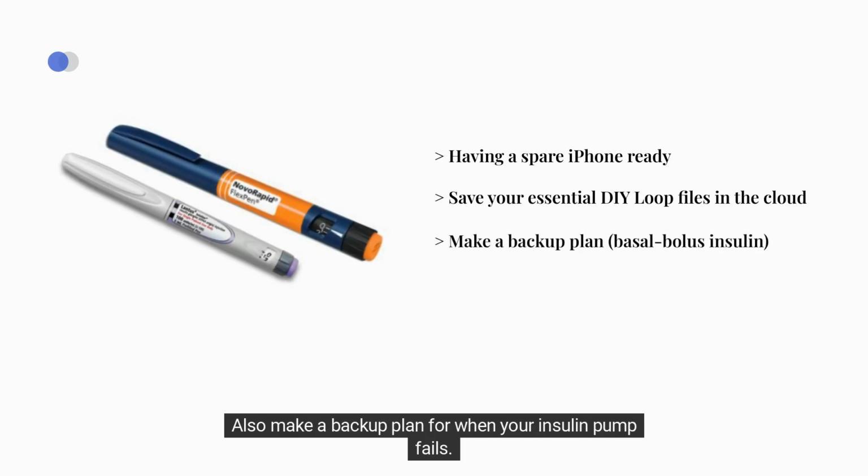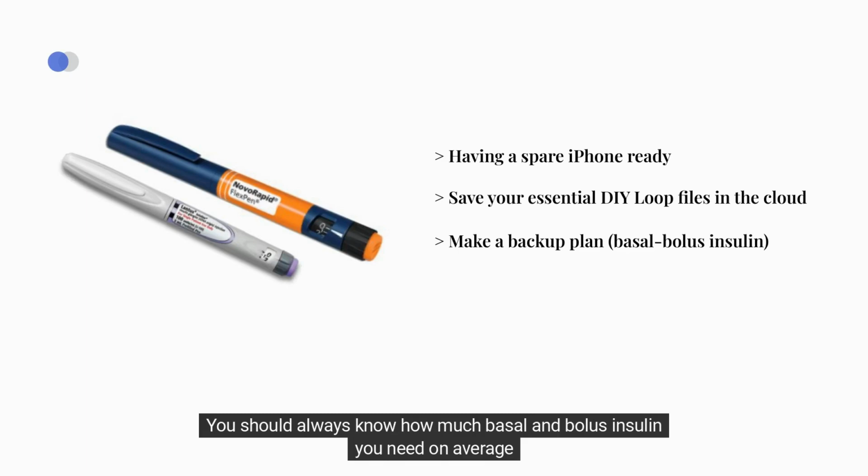Also make a backup plan for when your insulin pump fails. You should always know how much basal and bolus insulin you need on average, and be ready to switch to insulin pens in case of emergency.